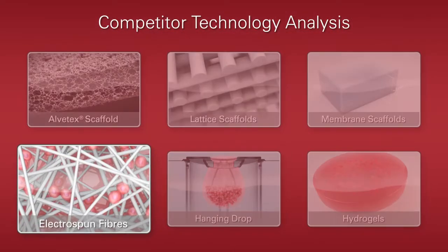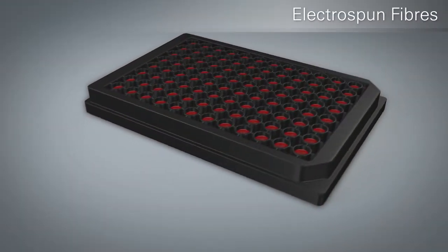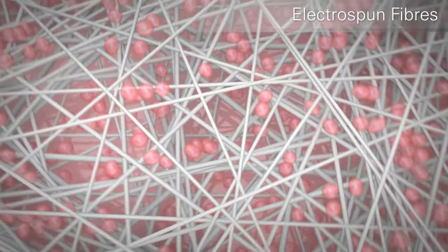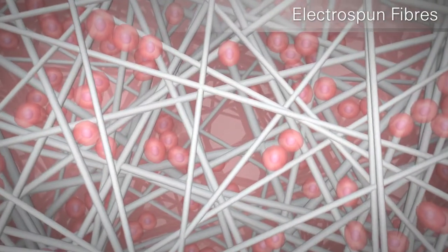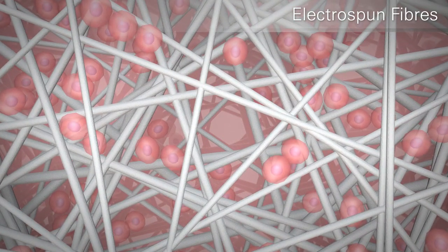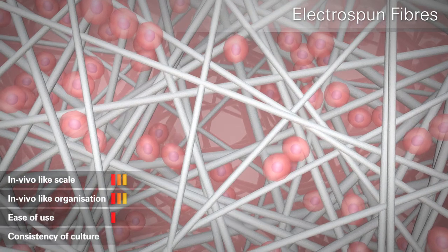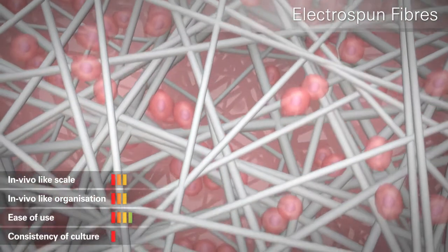Another form of scaffold is made from electrospun fibers. The drawback of this technology arises from the heterogeneous nature of the overlapping fibers. The variation in the size of the voids between fibers permits some 3D cell growth around the nodes where fibers overlap, but cells are unable to populate the larger voids, affecting a failure of organization.